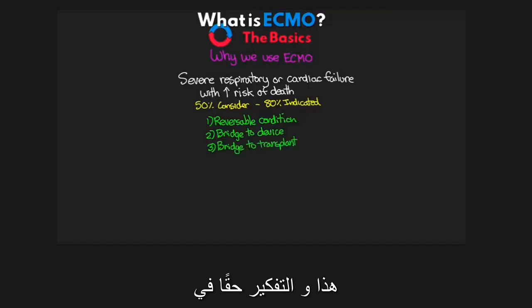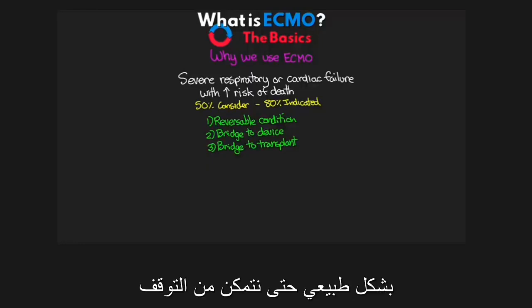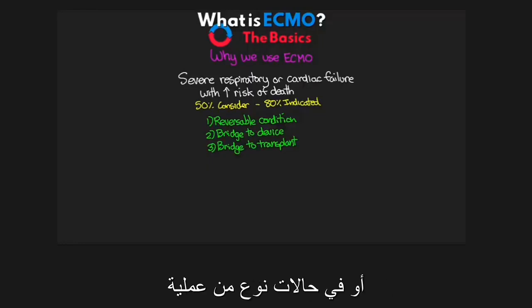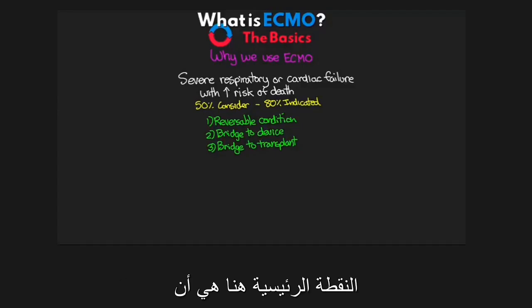And the reason to understand this and to really think about why is because ECMO is not any sort of treatment. ECMO is not going to fix the underlying problem of whatever's going wrong with our patient. It's merely a form of life support that's going to allow us time either for our patient to heal naturally so that we can come off, or in the cases of a device or some sort of transplant, to buy us time in order to be able to either implant a device or to get an organ transplant. So again, really key takeaway here, ECMO is not a treatment. It's not going to fix your patient.